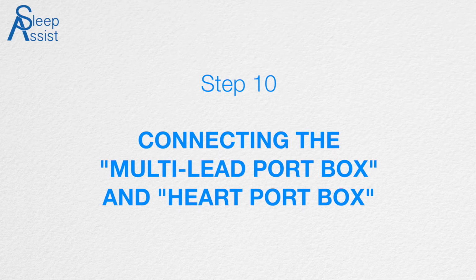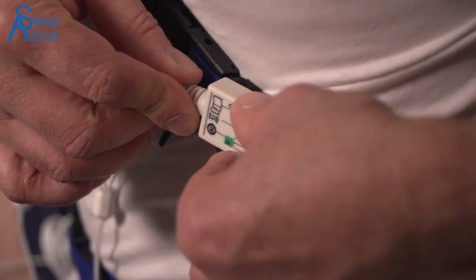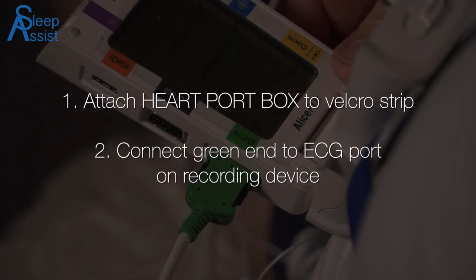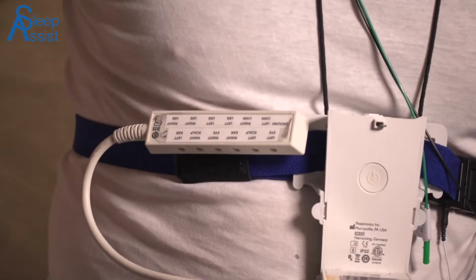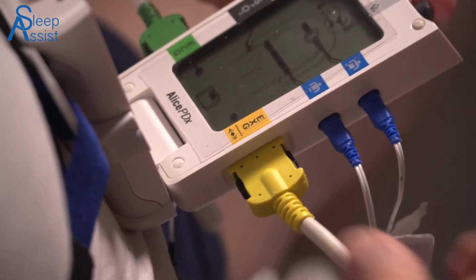Step 10. Connecting the multi-lead port box and heart port box. Attach the heart port box on the strip of Velcro on your left. Then plug into the green corresponding port marked ECG. Attach the multi-lead port box on the Velcro strip on your right, ensuring the labels are facing the right way up so you can read them. Then plug into the yellow corresponding port marked EXG.